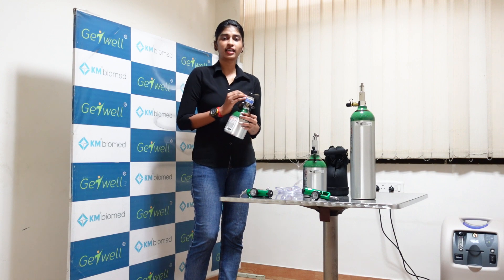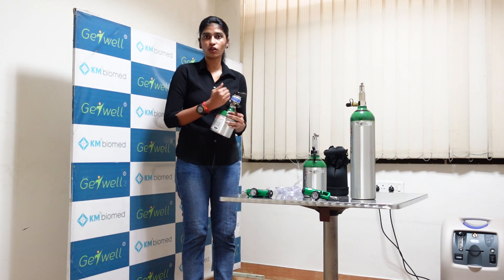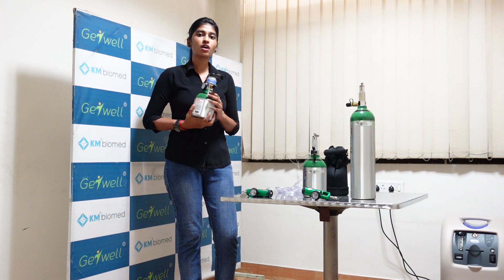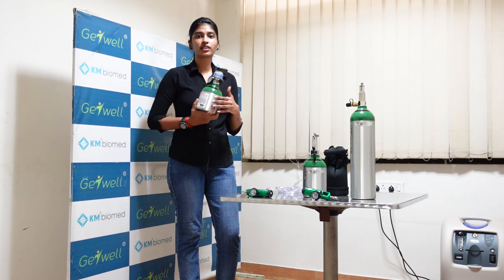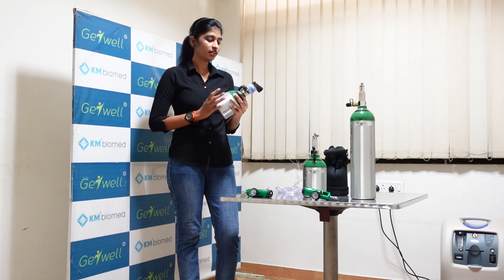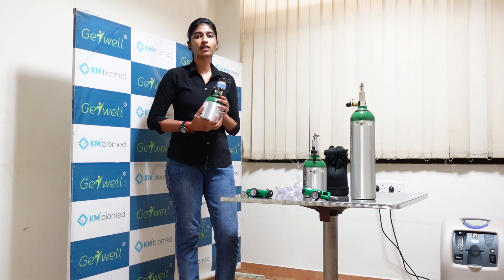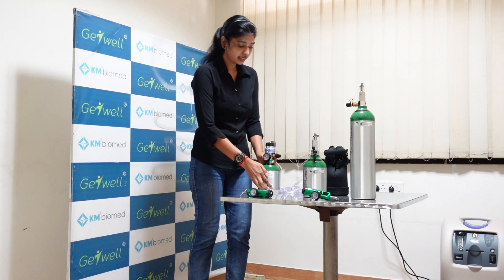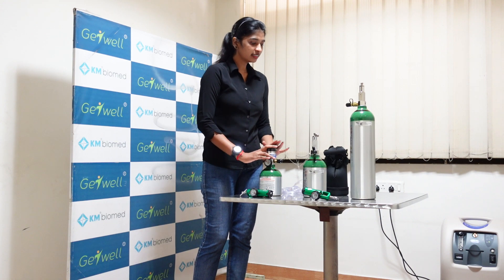Whenever the patient is exhaling, it will stop the oxygen delivery. So you can use it for 3 times the regular duration. For example, if you are using it for 1 hour, it will give you 3 to 4 hours of usage. Basically this cylinder will give you 4.3 to 5 hours when you keep it at 2 litres per minute.